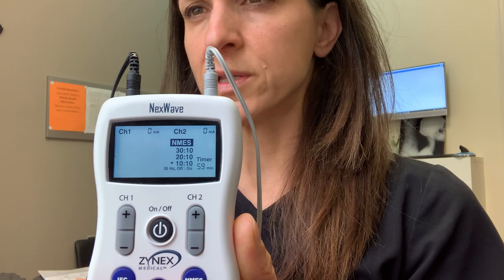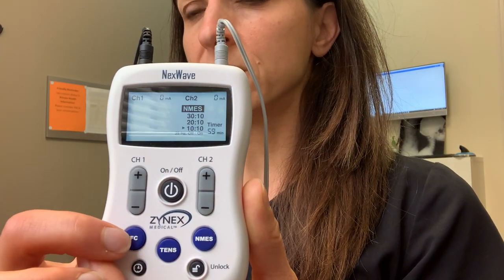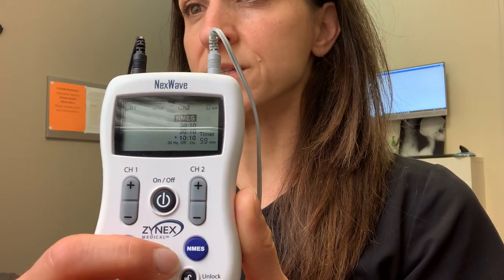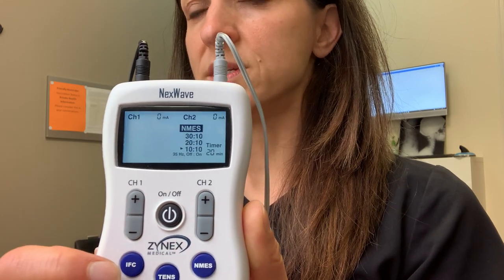I apologize — the words are backward on the display. You have the NMES setting here. If I recommended IFC or TENS to you, you would need to use these buttons to change to those settings. But we're going over the NMES setting today.